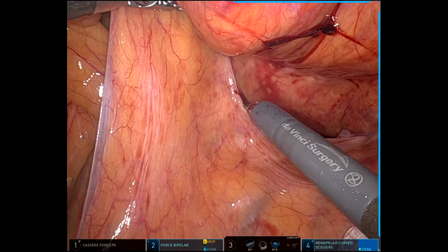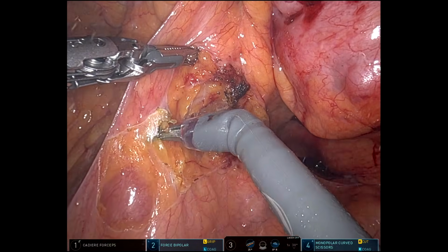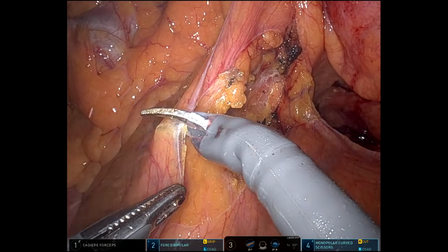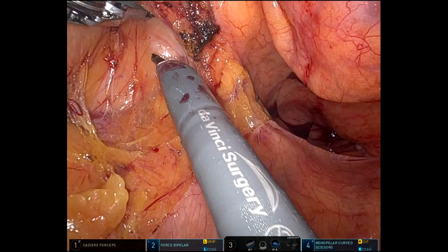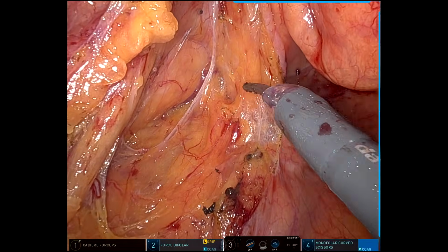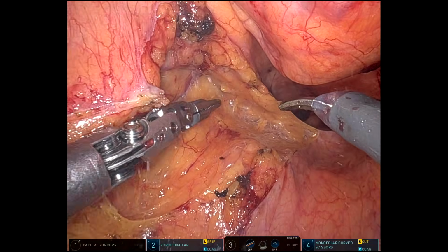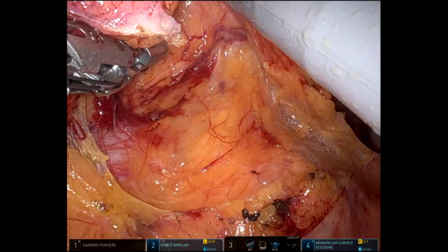I left the fistula takedown completely unedited because I thought that that was the money of this operation. But I'll start with a medial to lateral dissection. This is my usual routine for benign and malignant disease. And I find that in cases of really bad diverticulitis with phlegmon, this plane tends to be unviolated comparatively to the lateral plane. So I like to start in it and go as far lateral as I can.